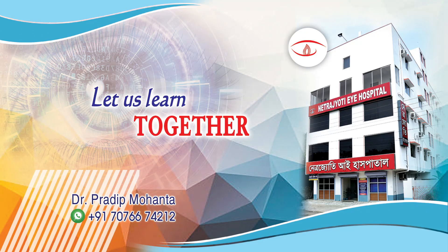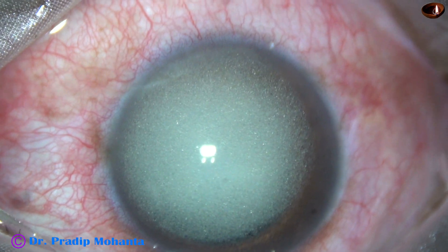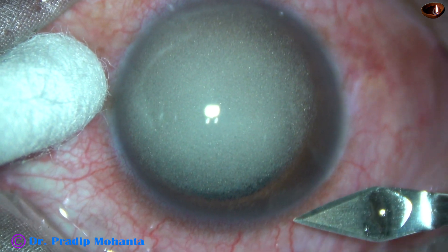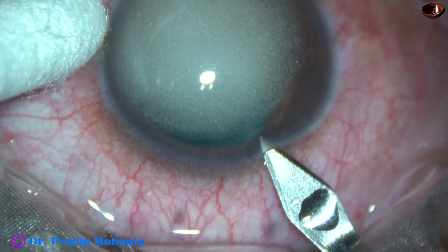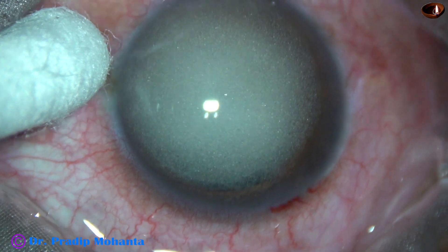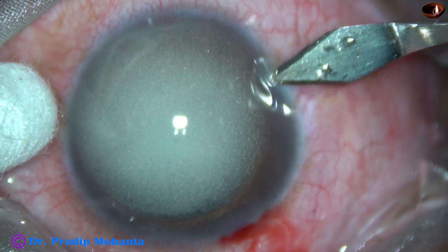Friends, welcome to my workplace at Ranaghat, West Bengal, India. This is emulsified silicon oil. The patient has undergone vitreo-retinal surgery in this eye about one year ago, and the silicon oil has come into the anterior chamber, probably through some zonular dehiscence.